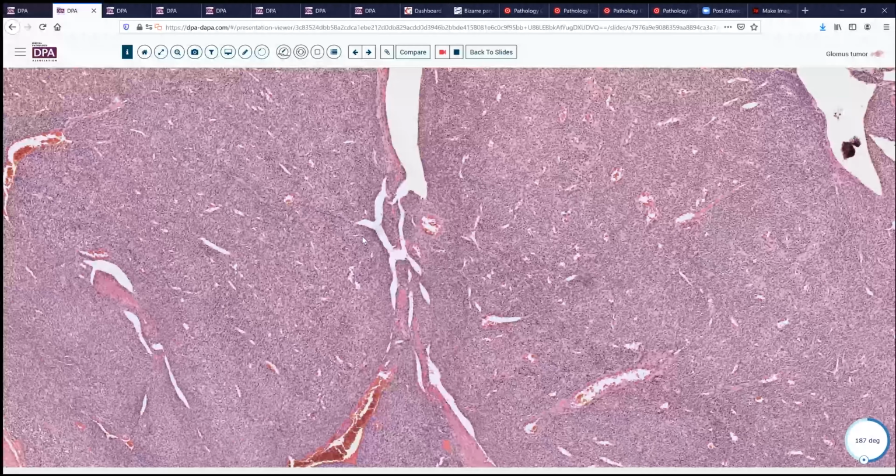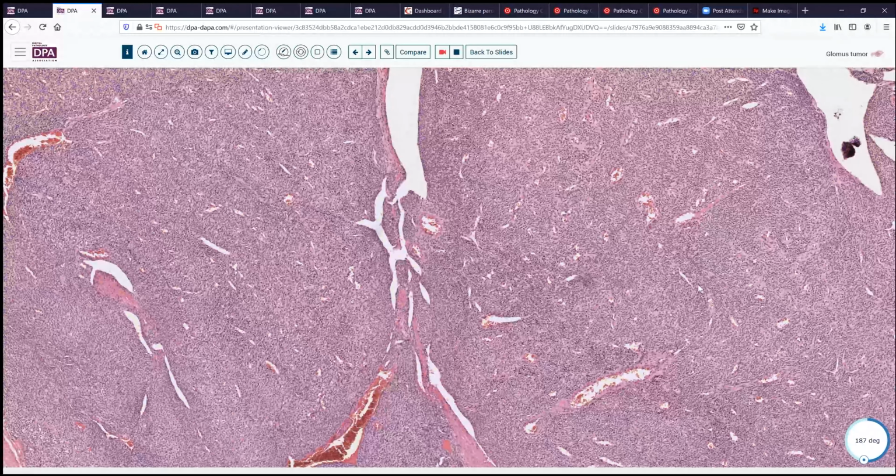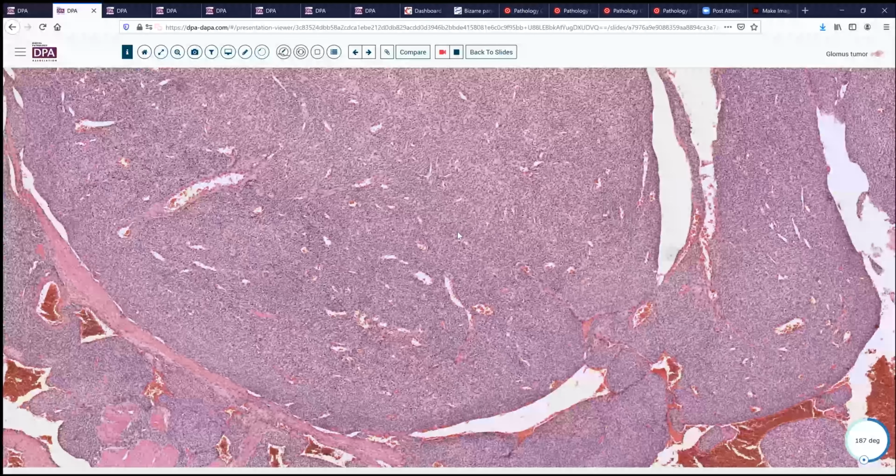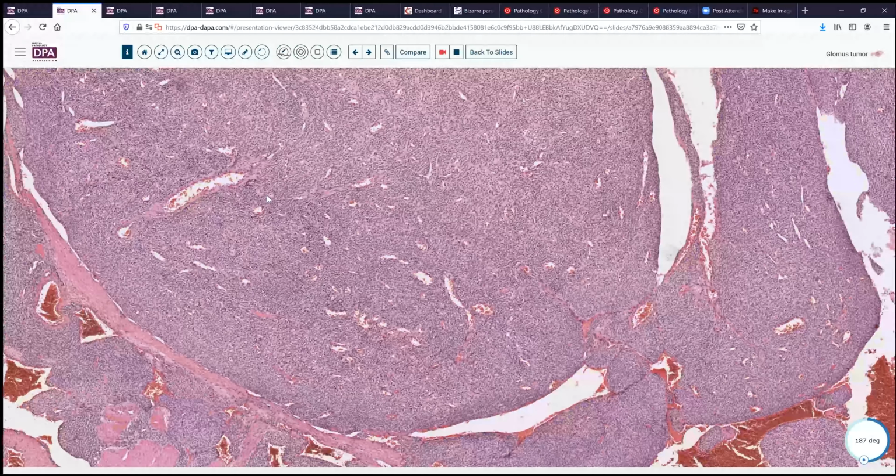We might wonder because of that about things like a hemangiopericytoma, like solitary fibrous tumor or something like that. And so the differential considerations as we approach the immunohistochemical workup would include those types of entities. A paraganglioma might also enter into the differentiation in light of the sort of packeting or rounded nodularity of some of these areas.